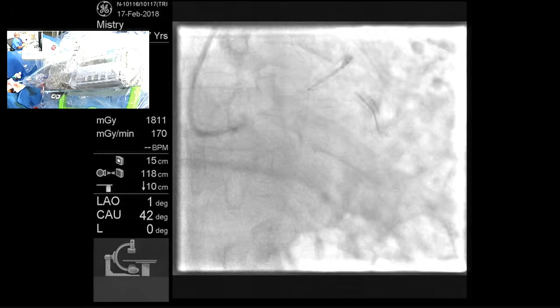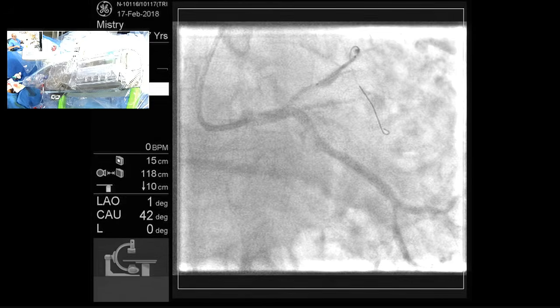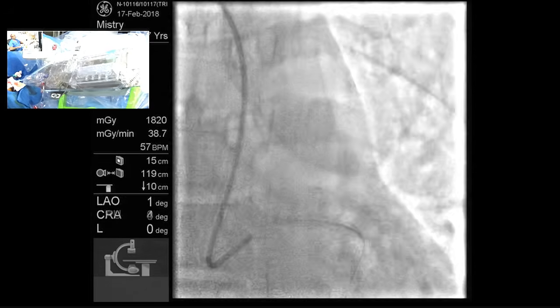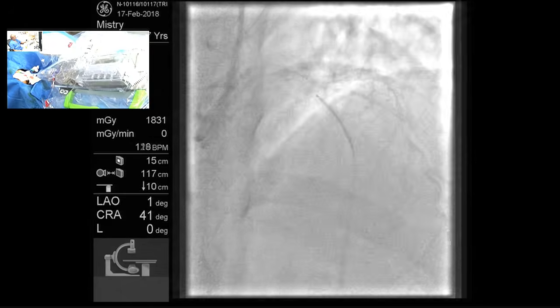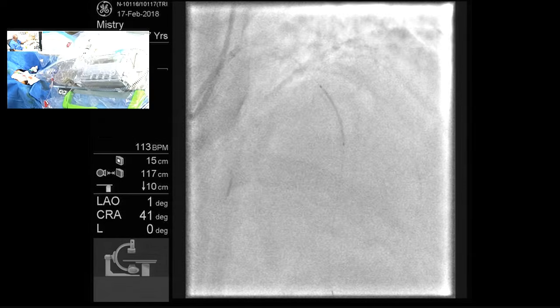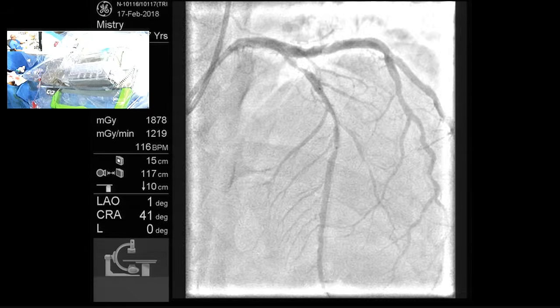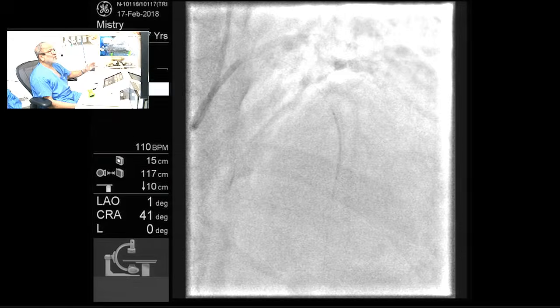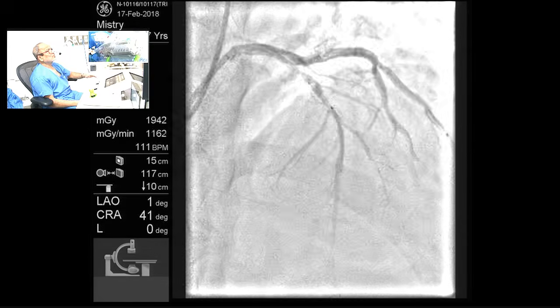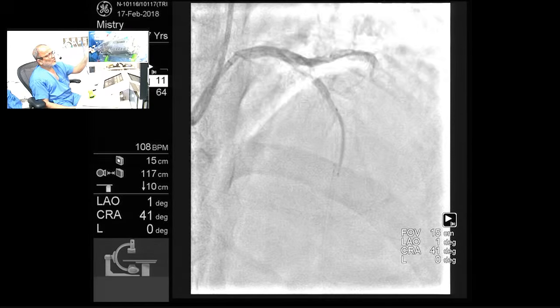Epicranial. Yeah, scout. Good. Epicranial. Scout. Okay, record. Perfect. It's okay. Okay, now again. Scout. We will overlap. Go.